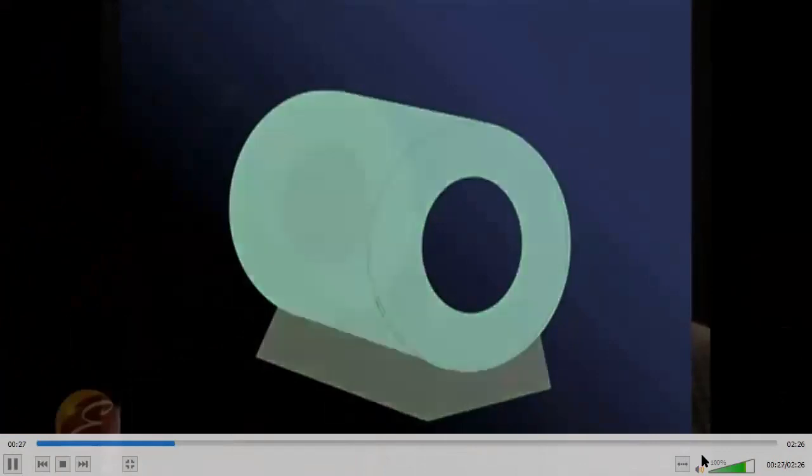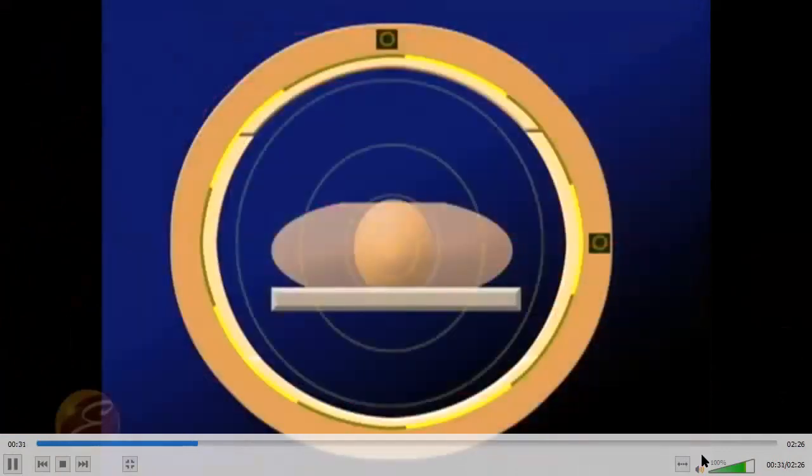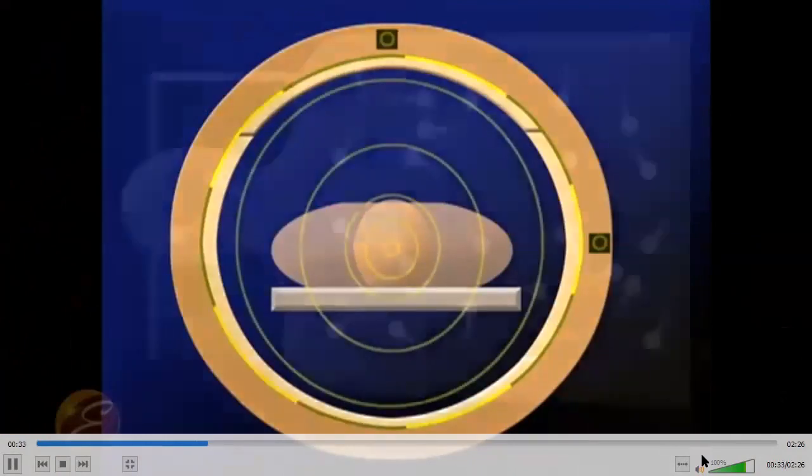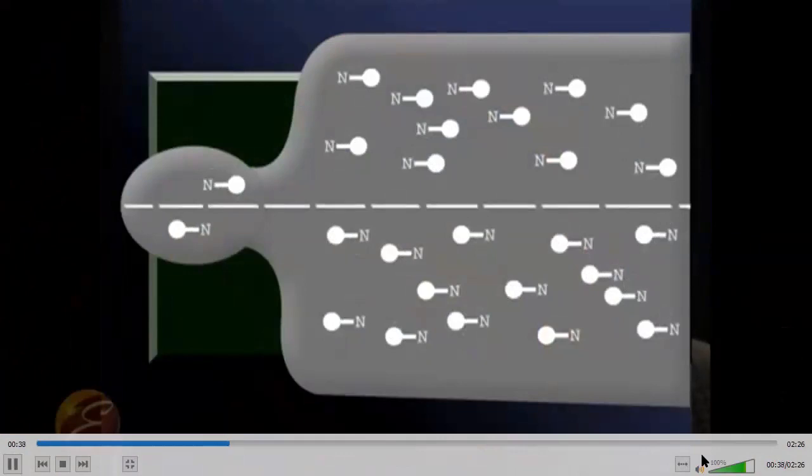If you take a human being and put him in one of these very homogeneous big magnets, there is a tendency of that magnetic field to line up the magnetic moments of the nuclei, the spin of the nuclei, and the hydrogen in your body, which is in your muscle and your blood.